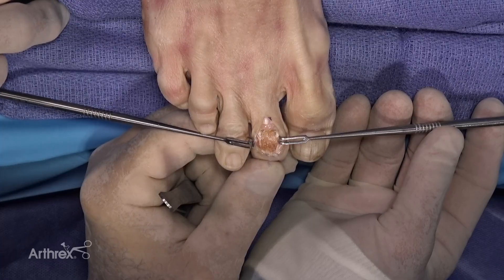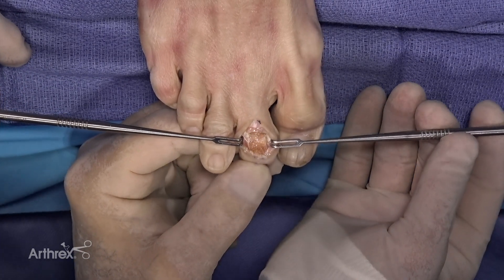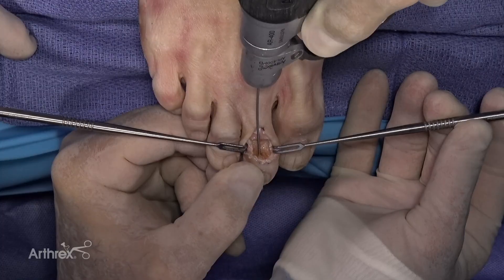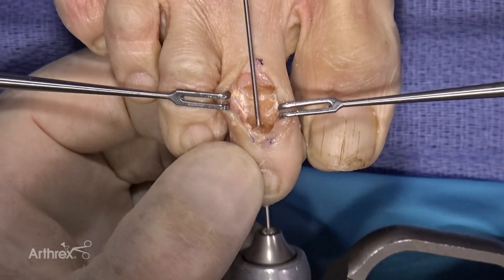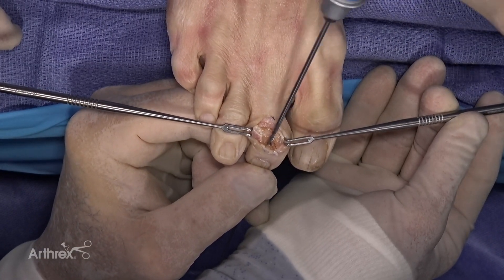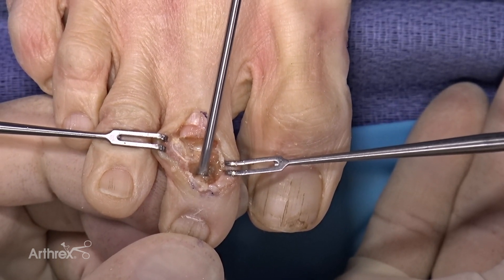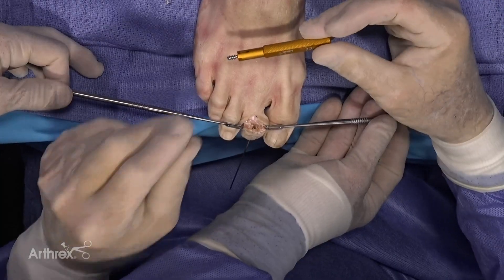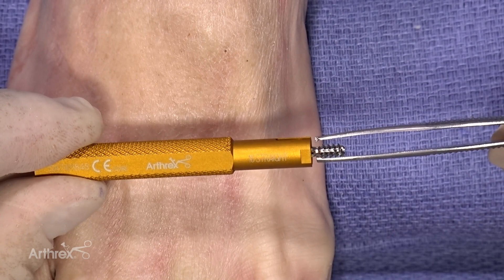Often the pin comes out with the drill and that's just fine — that's our prep there. We don't use any broaches at all. Now we'll come distally and place our K-wire from the middle phalanx, centering it and bringing it out the tip of the toe, leaving it proud by about two millimeters. With the K-wire steadied with my thumb and long finger, I bring the smaller drill into place, watching the laser line. I steady the pin so it won't come out, as I'll use it when placing the hammer toe device.